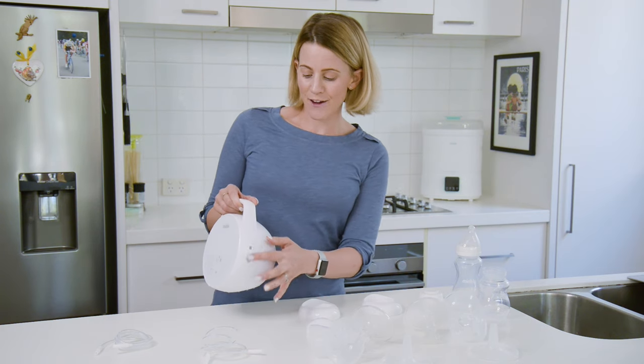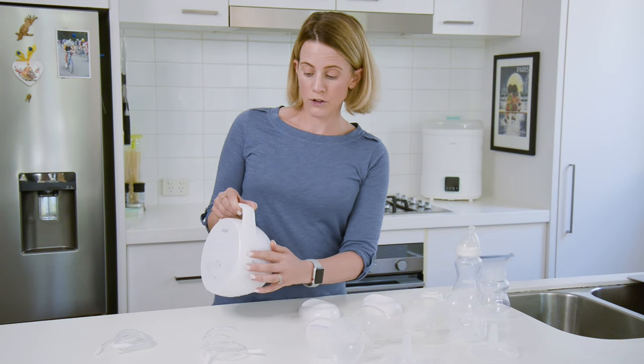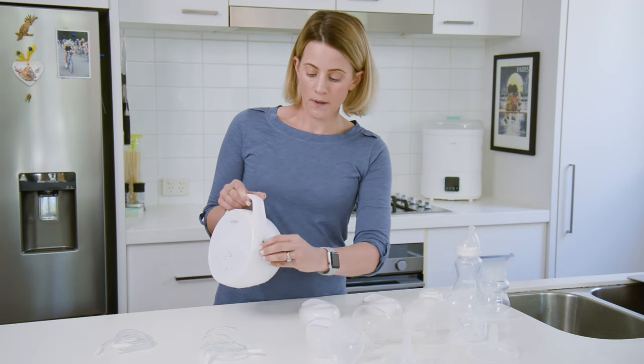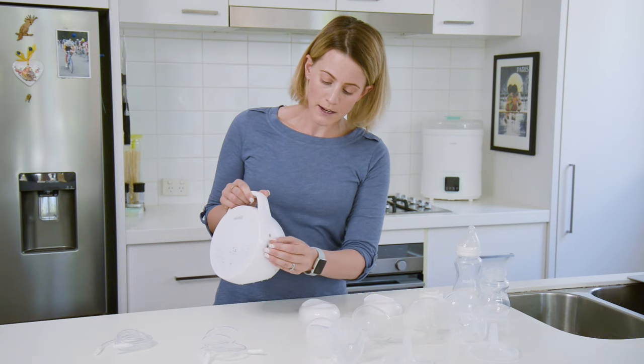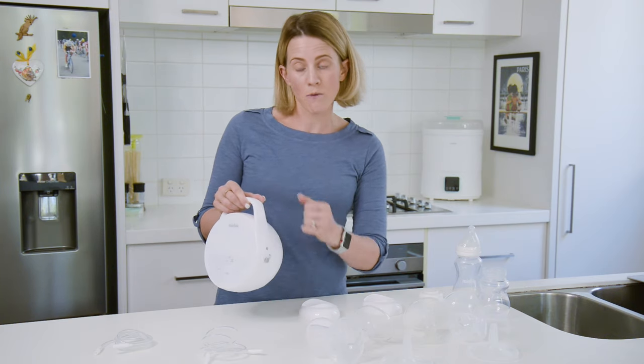I'm going to show you how to set up the breast pump. Over here, you can see if it's open, you would put two tubes in and that is for double breast pumping. I'm going to show you how to do it as a single breast pump — you put the cap in — so you'll just be pumping one side.